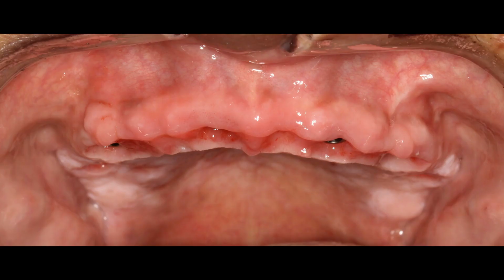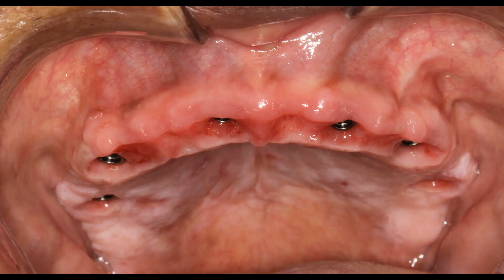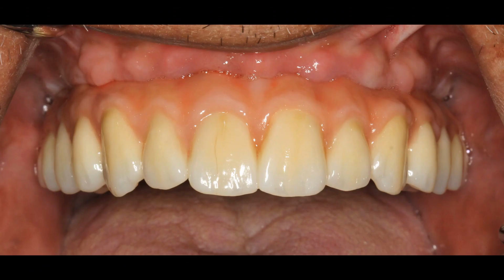This is the frontal view of the same beautifully developed tissues. This is a frontal view with a slight tilt so that you can actually see the ideal depth of the implants. Anything more shallow might show metal, anything deeper would be harder to clean. This is the day that we gave the patient the prosthesis with lips retracted.